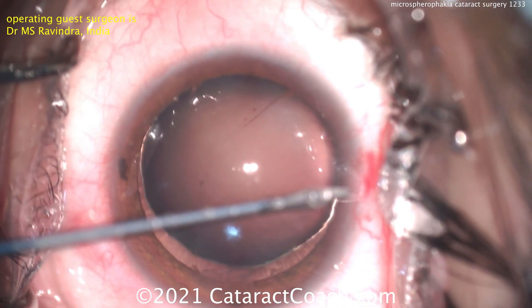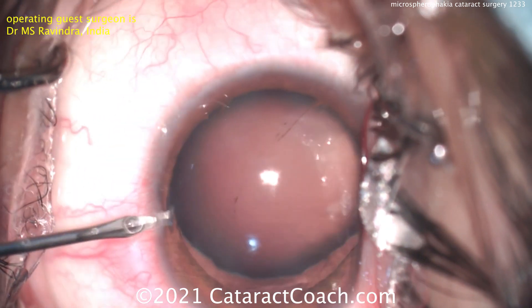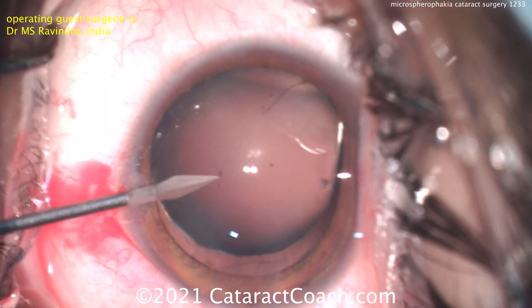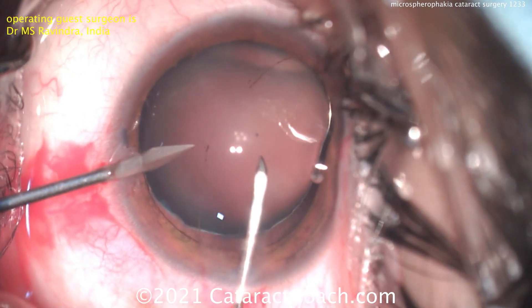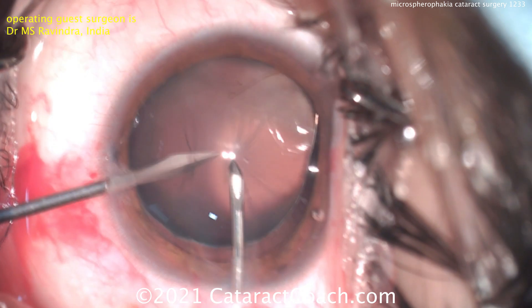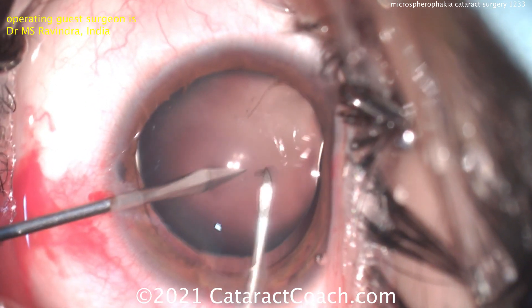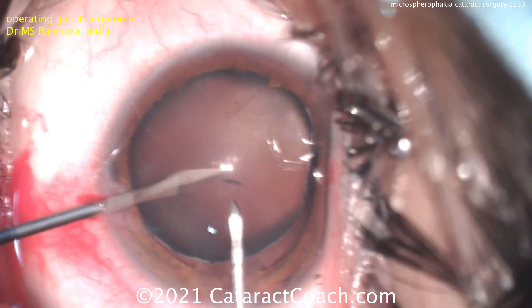Dr. Ravindra has a nice technique here. Using the side port blade in the left hand and a cystotome in the right hand — the blade is piercing the lens, which will help hold it in position. Using that cystotome, the bent needle, to help hold that in position. And now a capsulorrhexis can be turned.